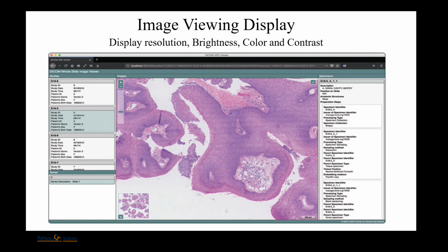Then they have areas where you can measure the length of the tissue, or you want to measure meds or something. You have those tools added in these.